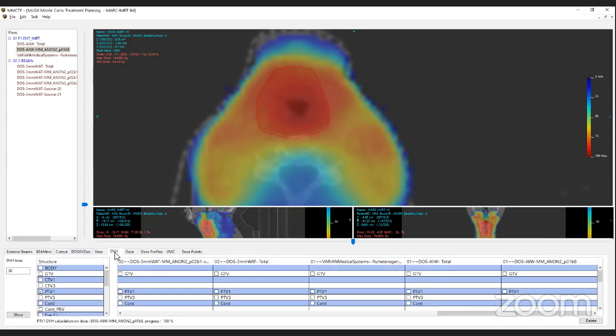Andrew, EGS has a feature of zeroing the doses to air. Oh, okay. I wonder if I've included that in dose XYZ. Yeah, I will look into it and let you know. The problem is then if you have air inside your patient. That is a problem, yeah. But probably you don't want doses to be recorded there. It's not of interest. Yeah, I can see what you're saying.